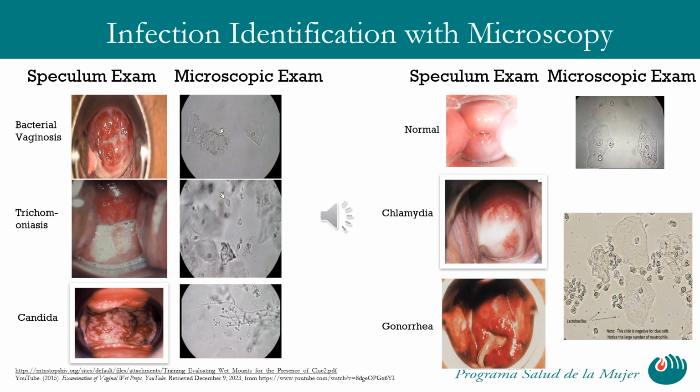Practitioners sometimes notice the absence of lactobacilli, signaling the disruption of normal vaginal flora. Next is Trichomonas with a thin, frothy, yellow or greenish discharge, and microscopically, the causative protozoan Trichomonas vaginalis with its distinctive flagella. The specimens must be viewed under the microscope within 10 minutes after collection to recognize the flagellate's motility.